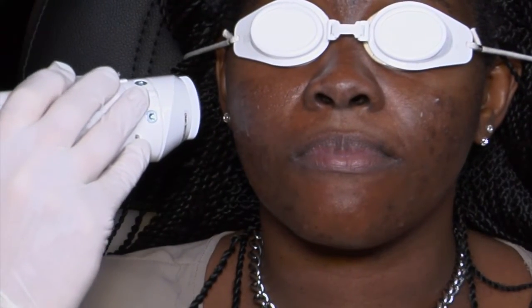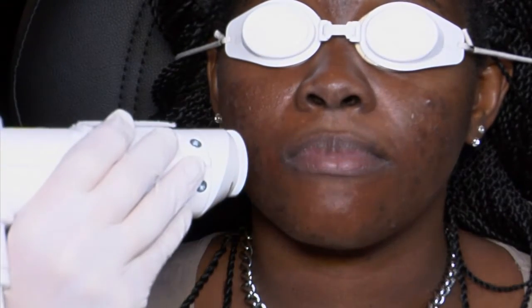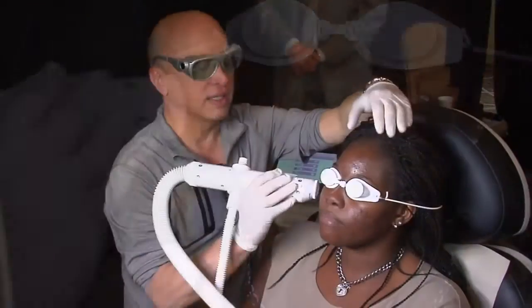Remember, this is type 6 African-American skin. This is not something that's easy to treat, no matter what. So it's great to have a device that can treat acne in this skin type.